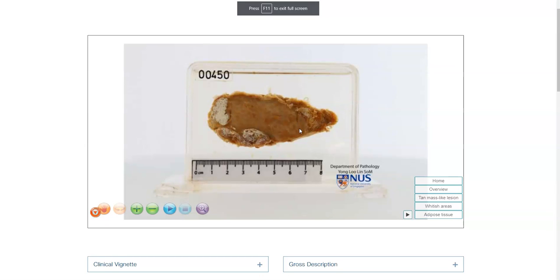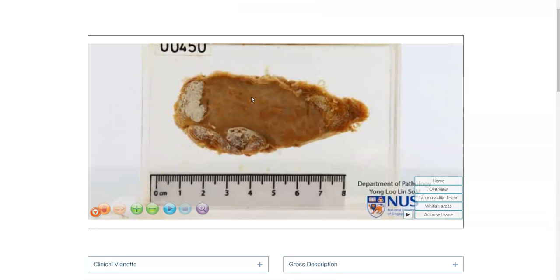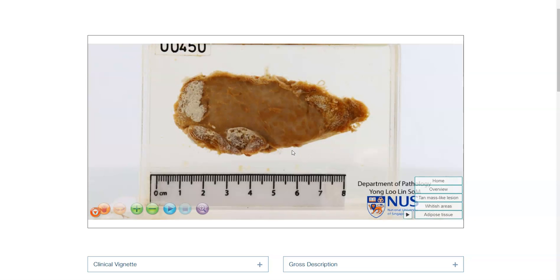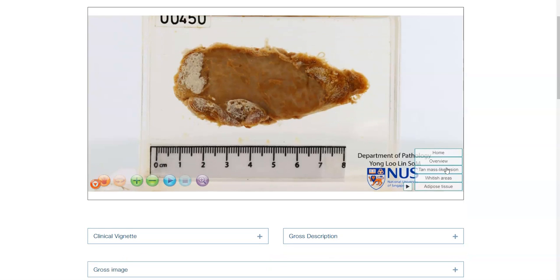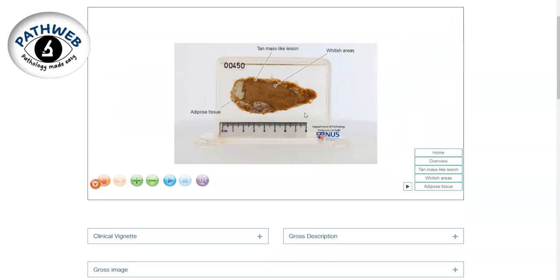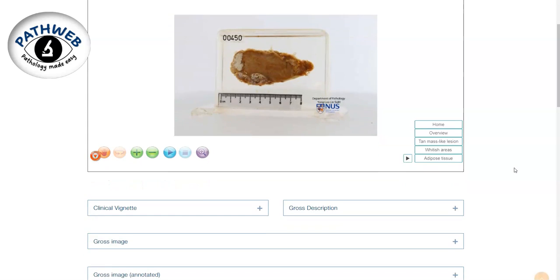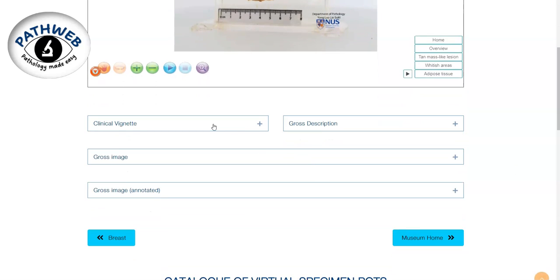In summary, this is an example of a virtual pathology specimen of gynecomastia, which is a benign lesion in the male breast. In this particular case, we see a well-circumscribed ovoid nodule with whitish fibrous areas intermixed with yellowish fatty areas. This virtual pathology specimen is fully annotated and interactive, and is taken from PathWeb, our free online pathology resource.